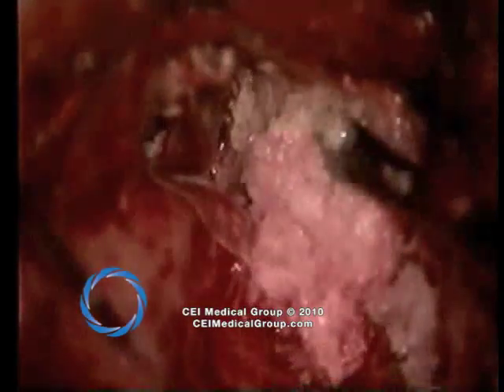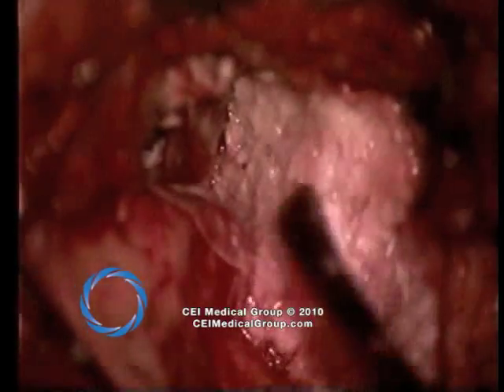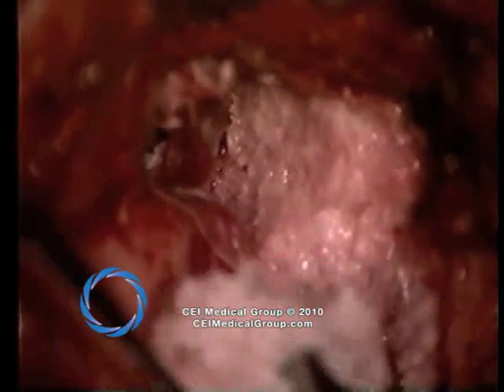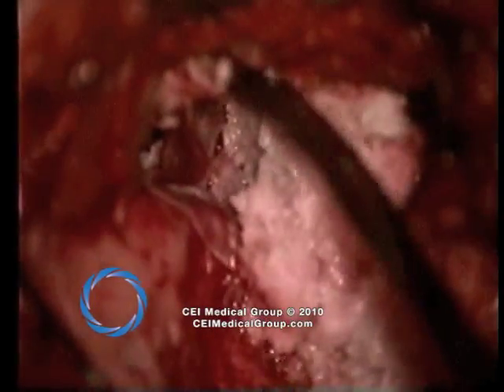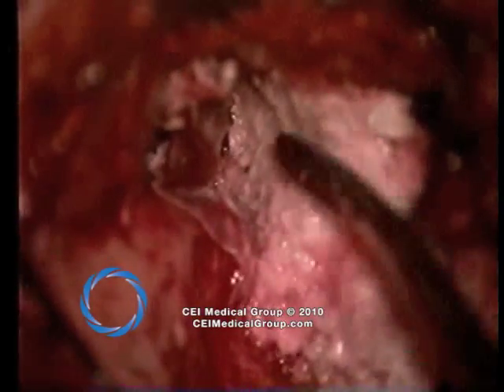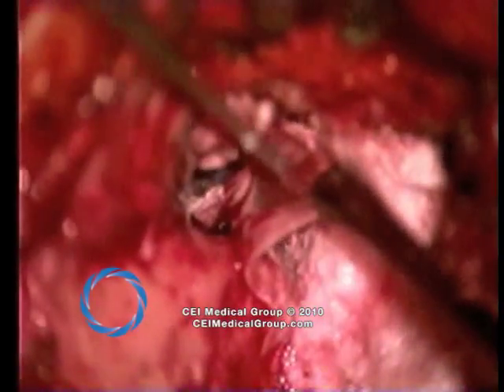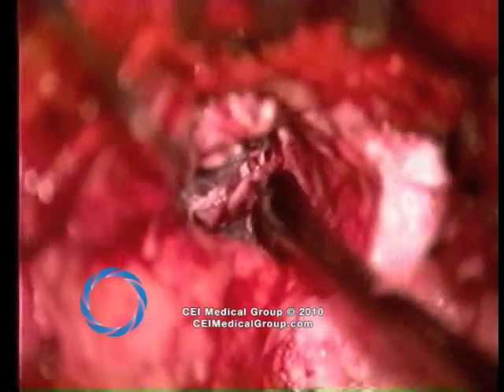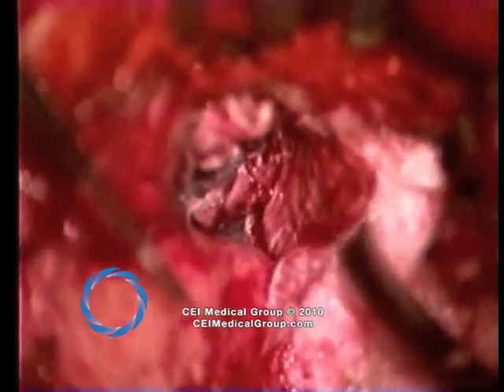The surgeon continues to sculpt the natural contour of the external auditory canal. By placing the fascia along the floor of the epitympanum and completely covering the pate, the autogenous cranial bone is separated from the middle ear space. Any exposure of bone pate through the ear canal or to the mesotympanum will produce an infection and loss of pate. Here you see the fascia being swung superiorly to completely cover the transplanted bone, and it should be of sufficient length to allow it to extend to the remnant bony margin of the mastoid bowl superiorly.